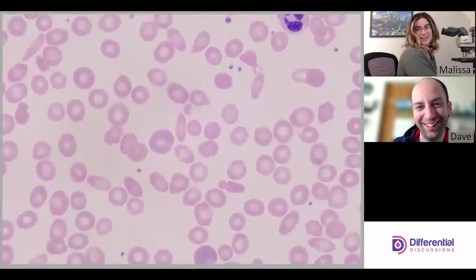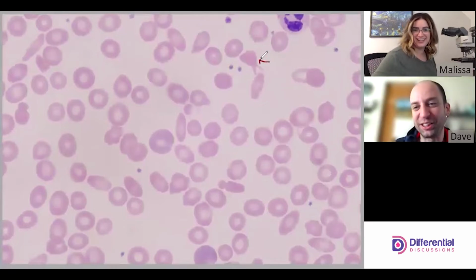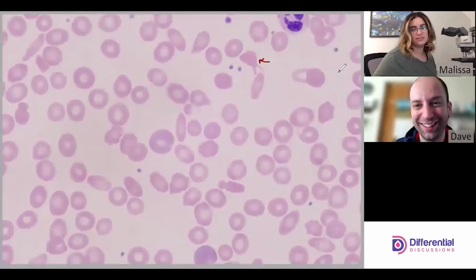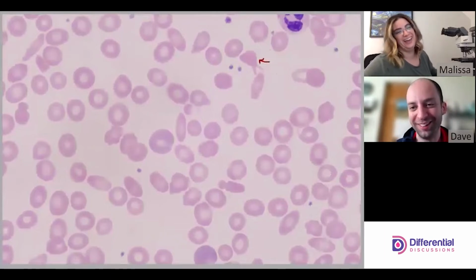Can you see it? Yeah, this little guy. It kind of looks like a slug, like with the antennae. Or like a basic outline of an upside down bunny. Bunnies are cuter than slugs. Yes, they probably are.